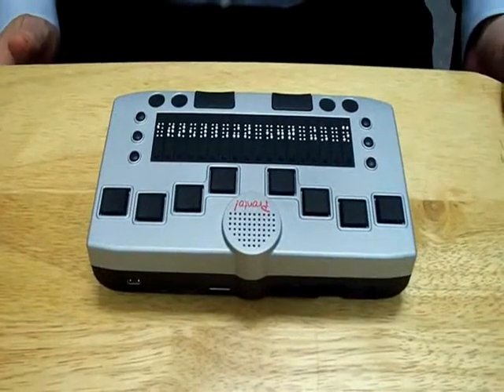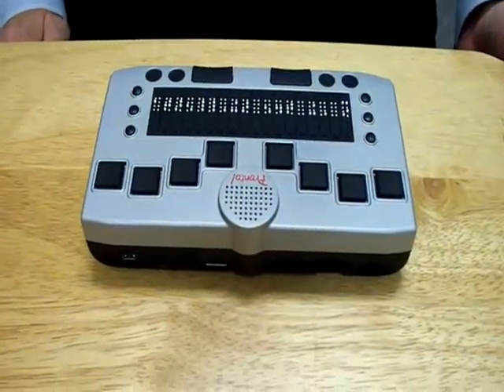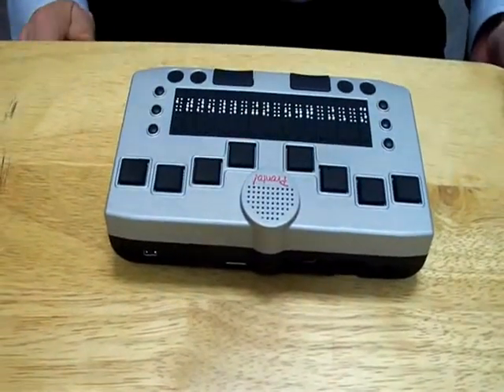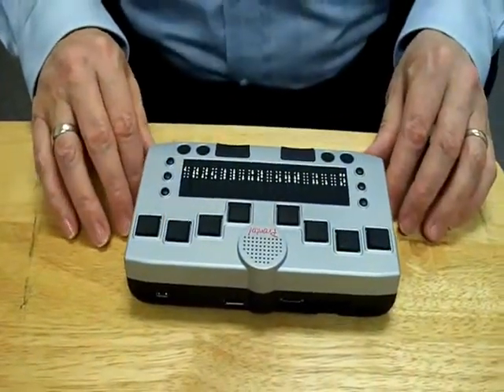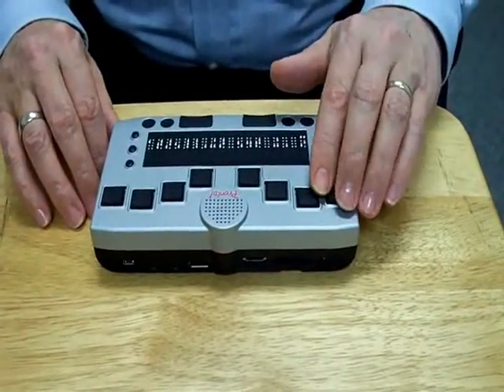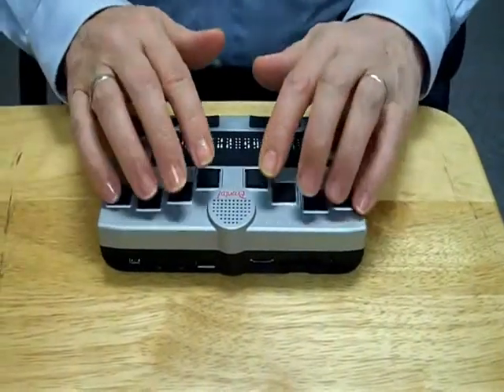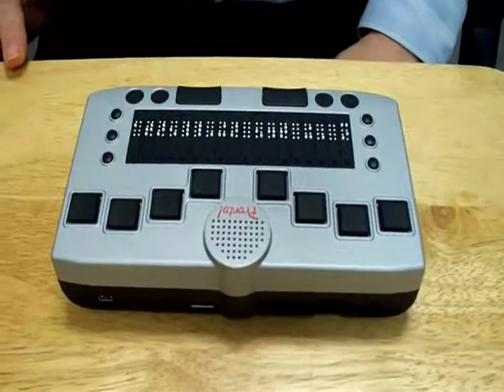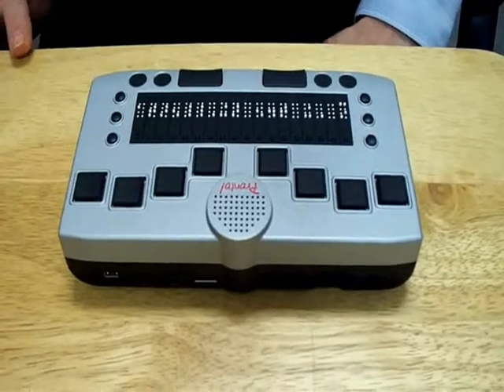For those not familiar with Braille, this corresponds to the 8-dot Braille cell. Used to be it would be just 1, 2, 3 on the left, 4, 5, 6 on the right, but 7 and 8 got added, and so 7 went on the left, at the far end of the left, 8 went to the far end on the right. Behind the Braille keys is the speaker, kind of the round circle, slightly raised above the surface of the unit.